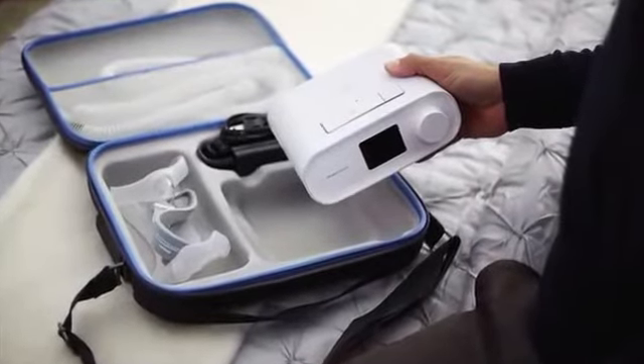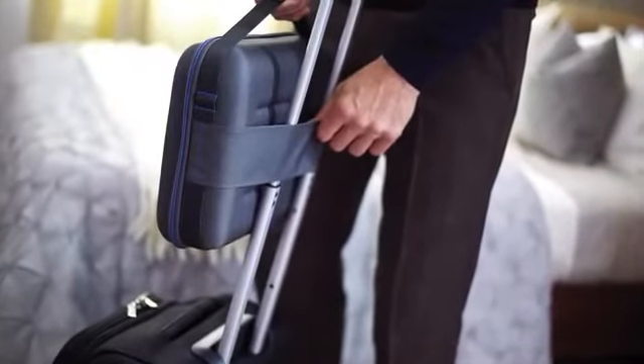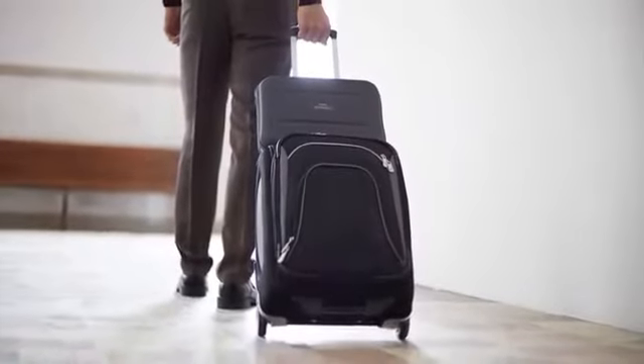The DreamStation Travel Kit is a good way to pack up and take your therapy with you. This lightweight case makes for easy portability and offers discretion when traveling with your PAP device.